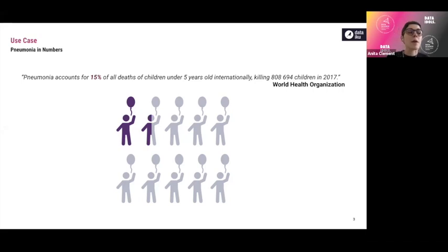That's why I think there's a huge potential for machine learning to automate that first part, which is the image screening in pneumonia detection, because it could help at prioritizing and expediting this first part of the process. Even if for you and me it could be really hard to detect anything on a radiograph, machine learning looks at the actual value of each pixel, so it's easier for an algorithm to do the detection.